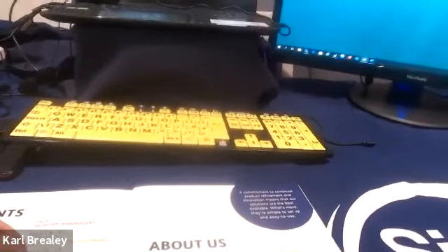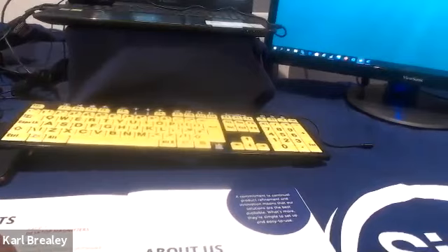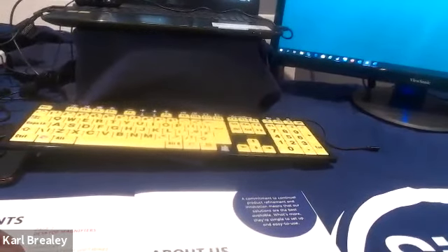Now, I guess I could try some different formula or whatever on there, but it read that out as it should do: 40 plus 40 equals 80. Obviously, it's not worked out the math problem itself. I've put the answer in, but it has actually read it as an equation. Yeah, I was impressed it read the punctuation. Thanks, Donald. You heard that, good.